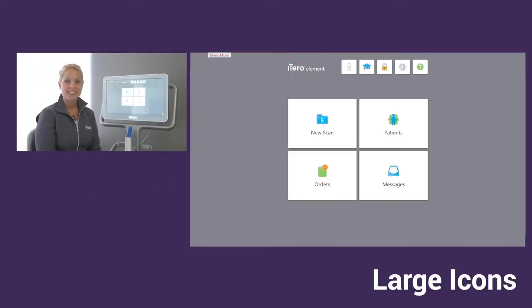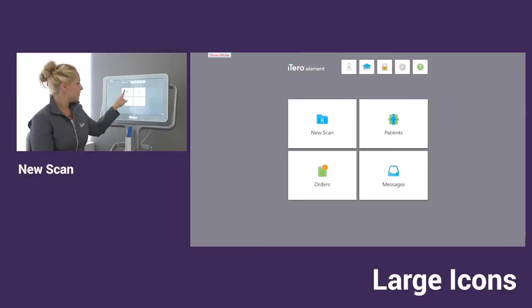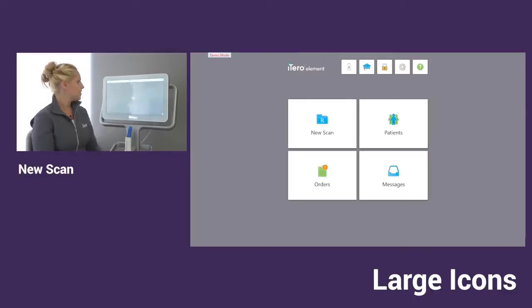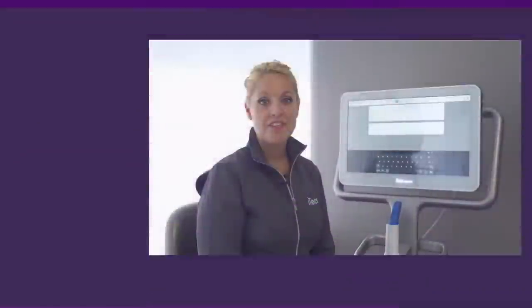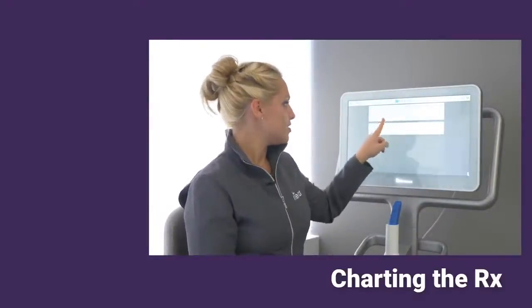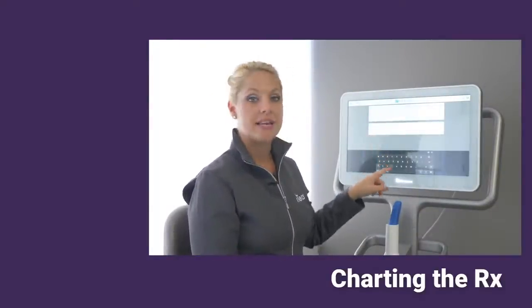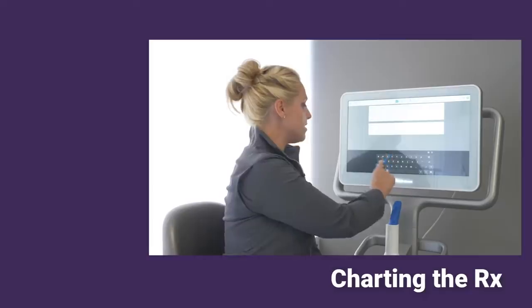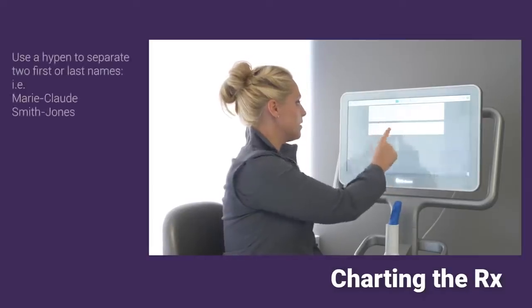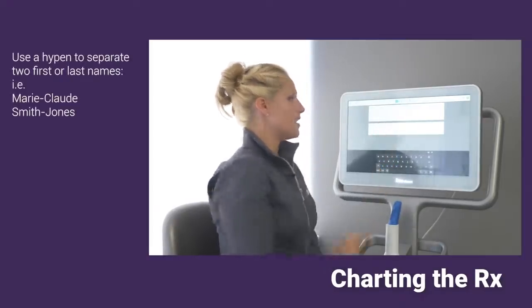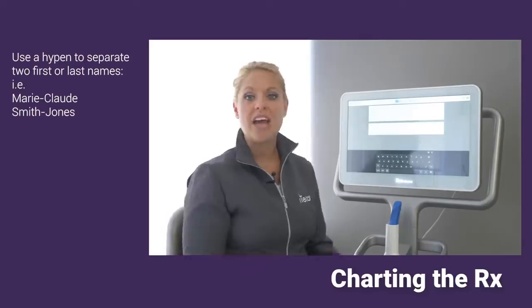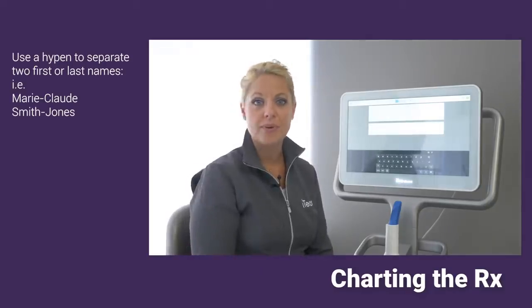The last icon left to cover is the new scan. With new scan, we're going to talk about some charting. To chart for your new patient, you can tap on the patient's first and last name. I'm going to put test in today.